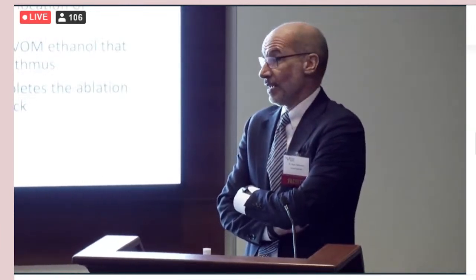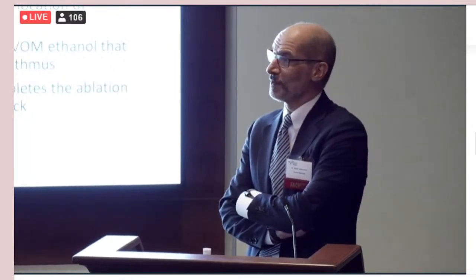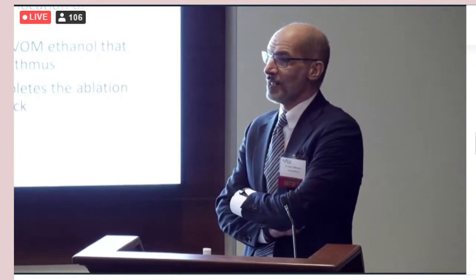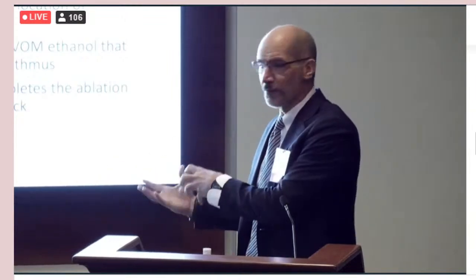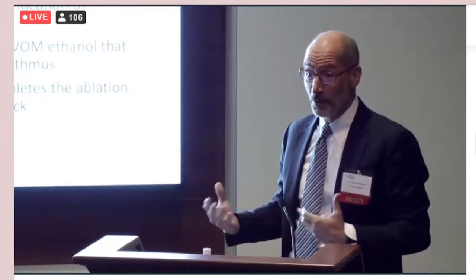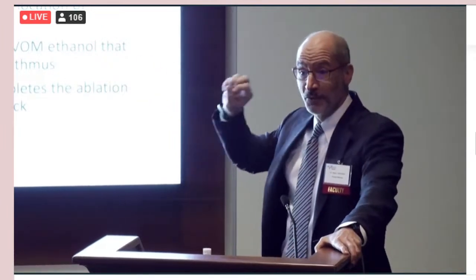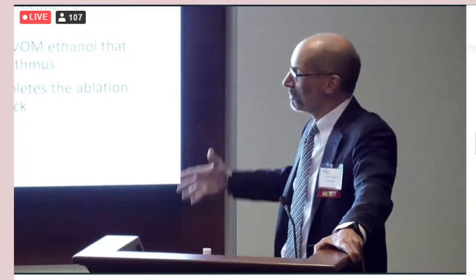Do you think we will need this with PFA now that we can probably... I don't know. I tell you, what I hear about PFA is that it can be wonderful, but every time I see a case, there's some tuning of the waveforms or tuning of the parameters. It's like, okay, if you have to tune it, it's because it wasn't that wonderful to begin with. So there's a lot of empiricism here as to, well, we have to use these pulse settings in order to get a permanent lesion. I don't know.